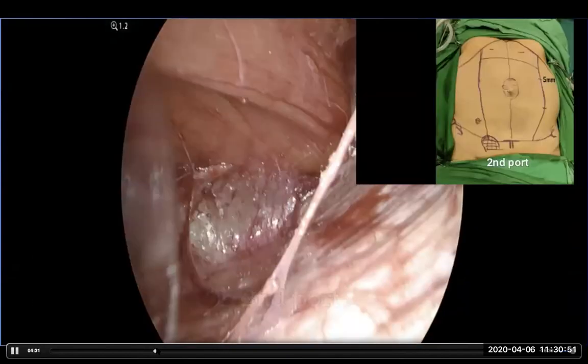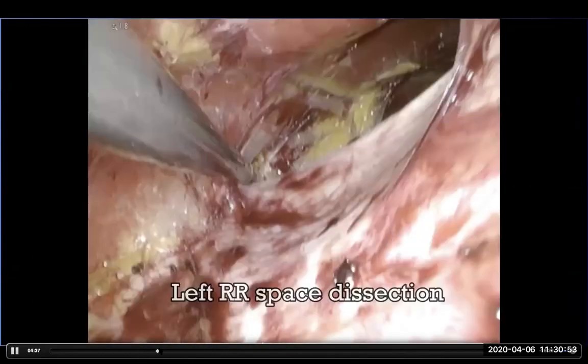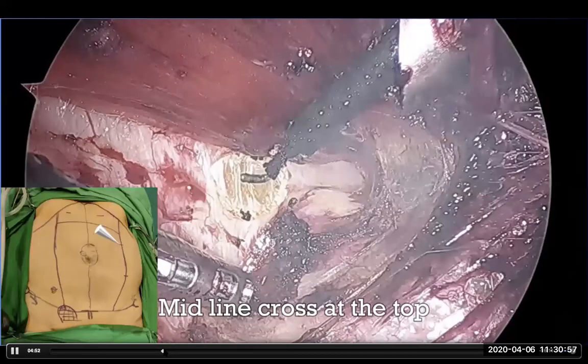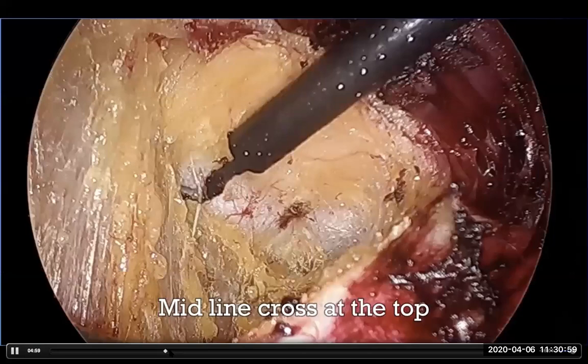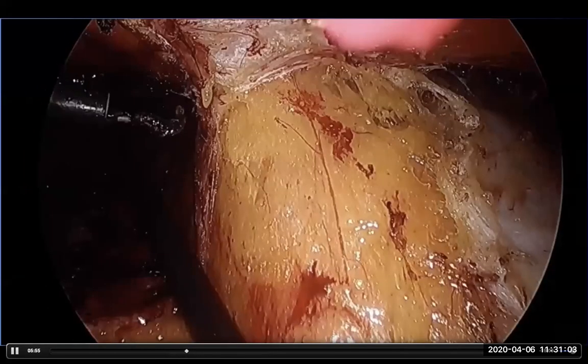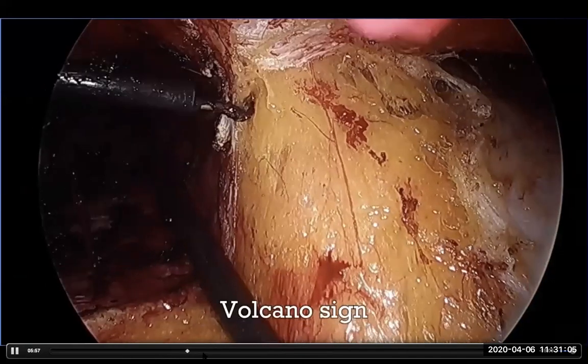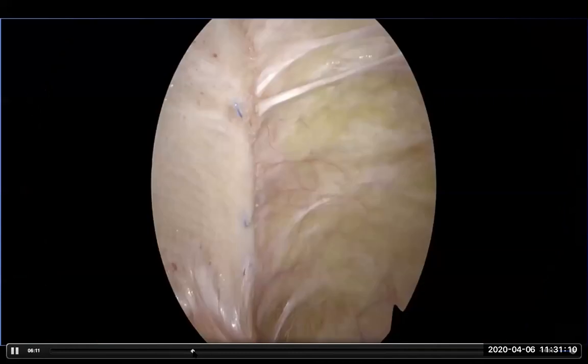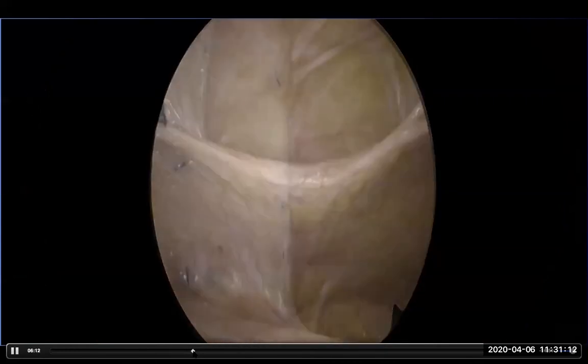I'm not going in there. And this initial part is the Rives-Stoppa operation, which I'm not showing. So we'll just fast forward to the part where we can actually go into the TAR. So you can see that this is the Rives-Stoppa, and we are pushing down the PRS.